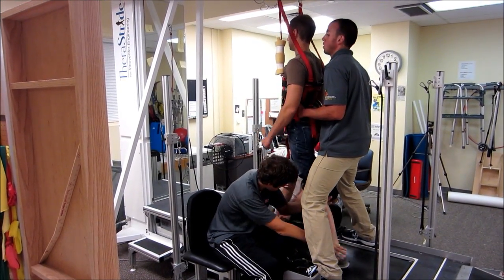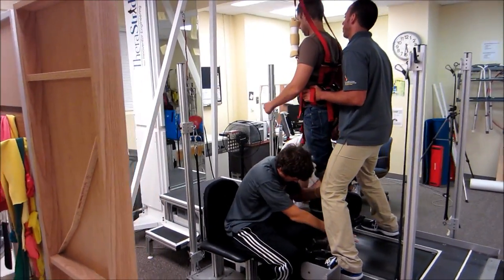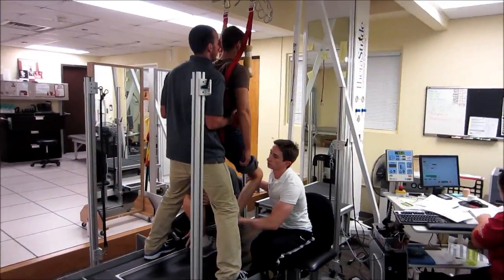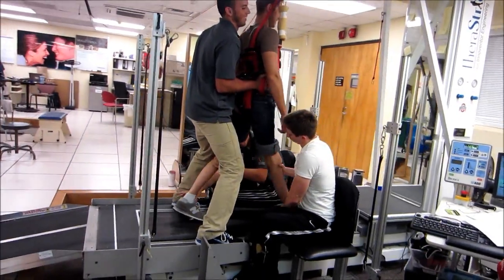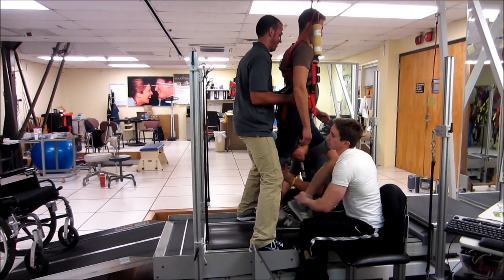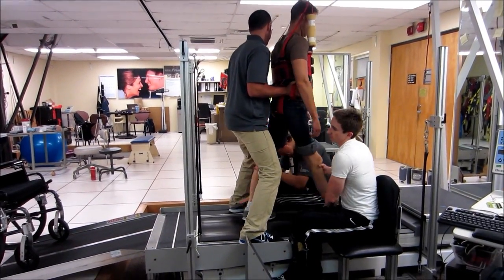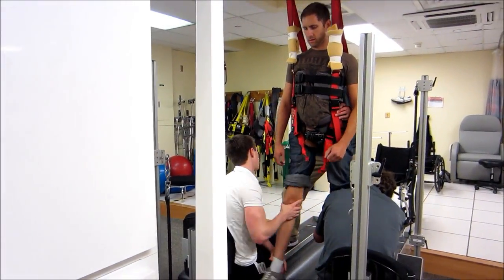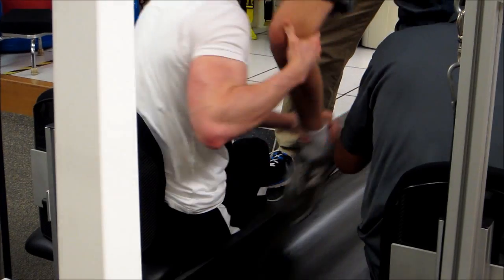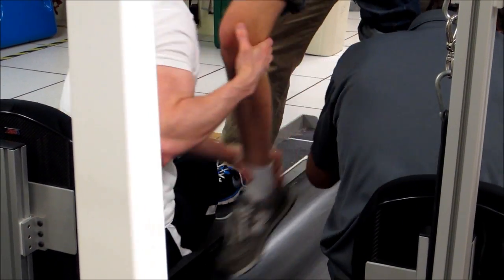Just for another minute or so, we'll get down. If only all of our patients are such quick learners. We've seen some crazy arm loops. Alright, I'm going to go ahead and stop.